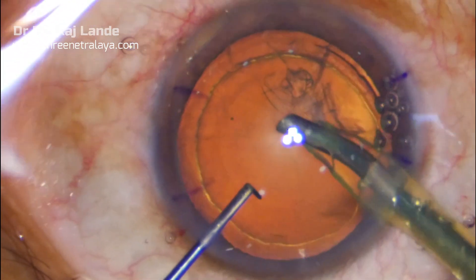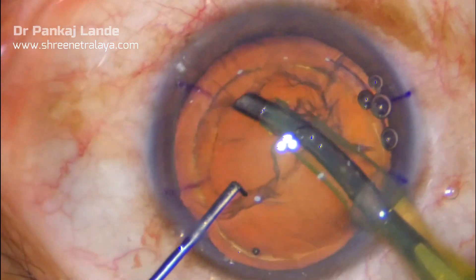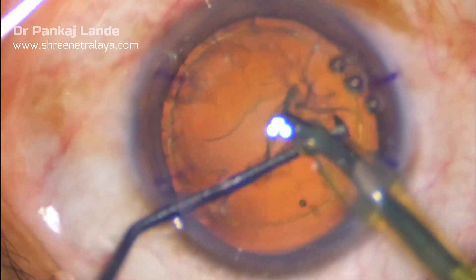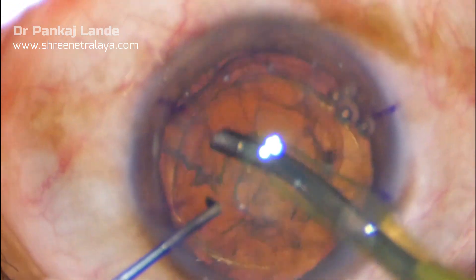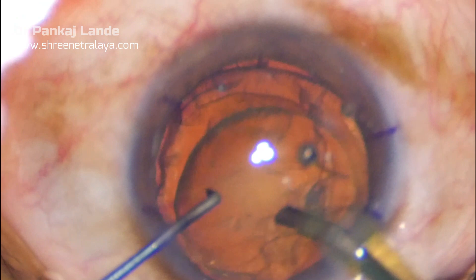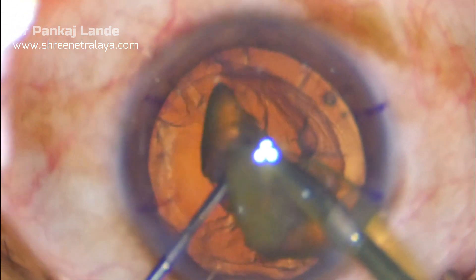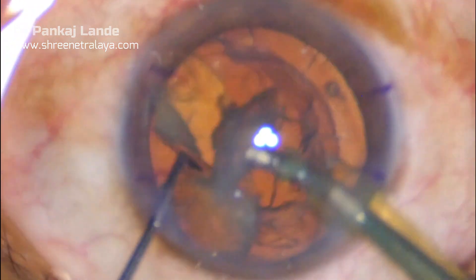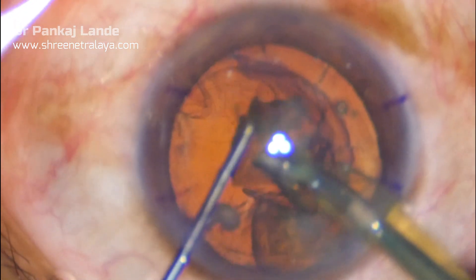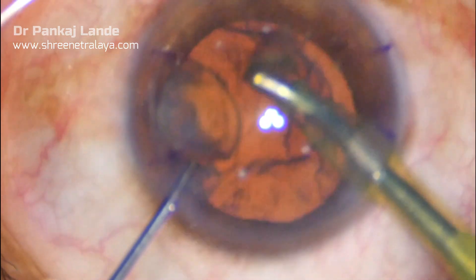As this eye is myopic, the AC depth will be very high. The nucleus is chopped into multiple pieces and finished. As ACD is more, you can see the nucleus has turned vertical. Just avoid touching the corneal endothelium with these pieces.